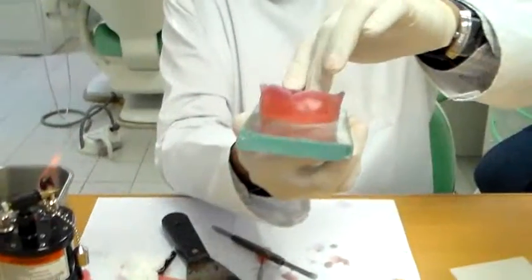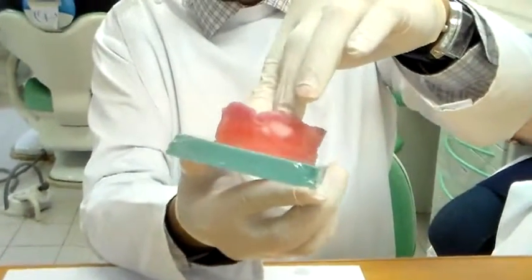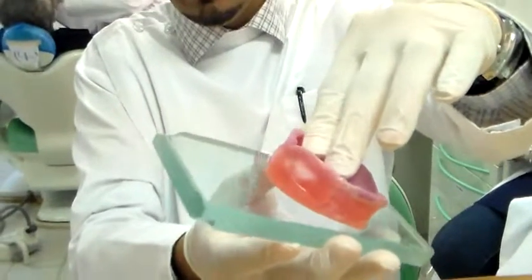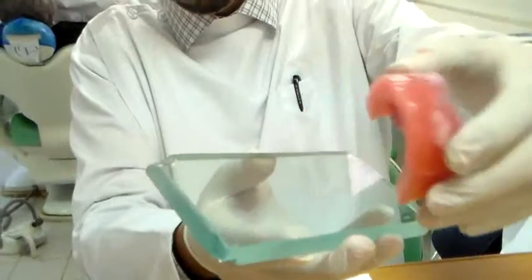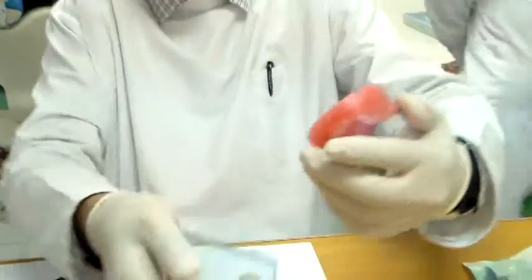Place it on a glass plate and see if there's any spaces. Okay. And it's okay. And I think it's fine.